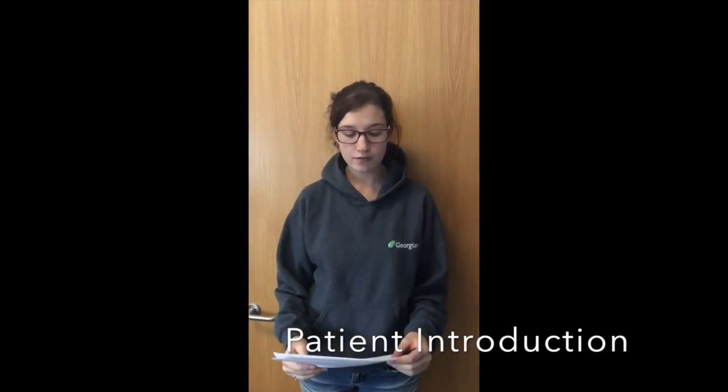We'll be doing a blood transfusion. The patient's history, they're a 14-year-old girl. Her name's Kelsey Walter. Her mother will be accompanying her during this procedure. Kelsey is diagnosed with severe anemia. She'll be receiving 500 milliliters over 4 hours of AB positive red blood cells with a 500 milliliter normal saline bag.